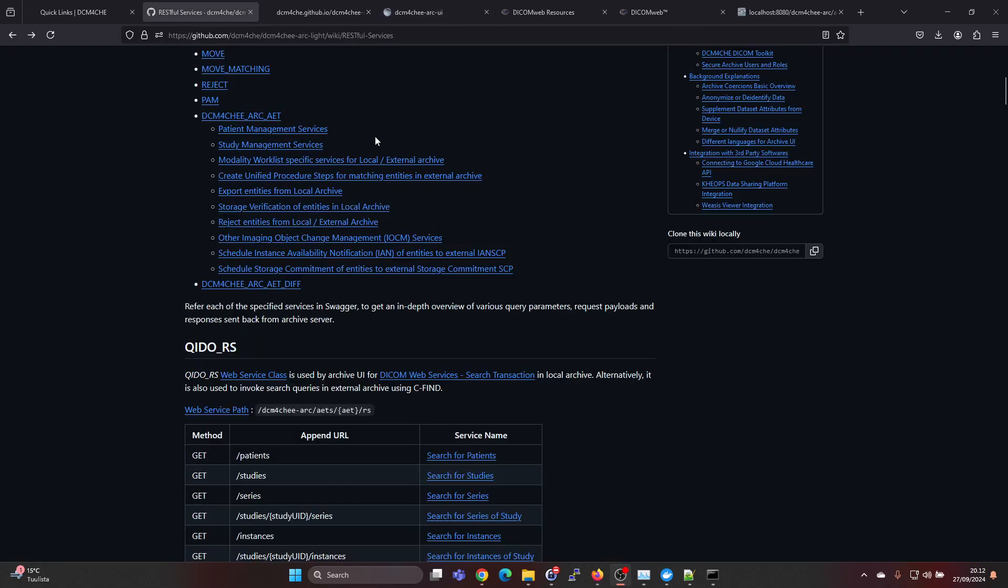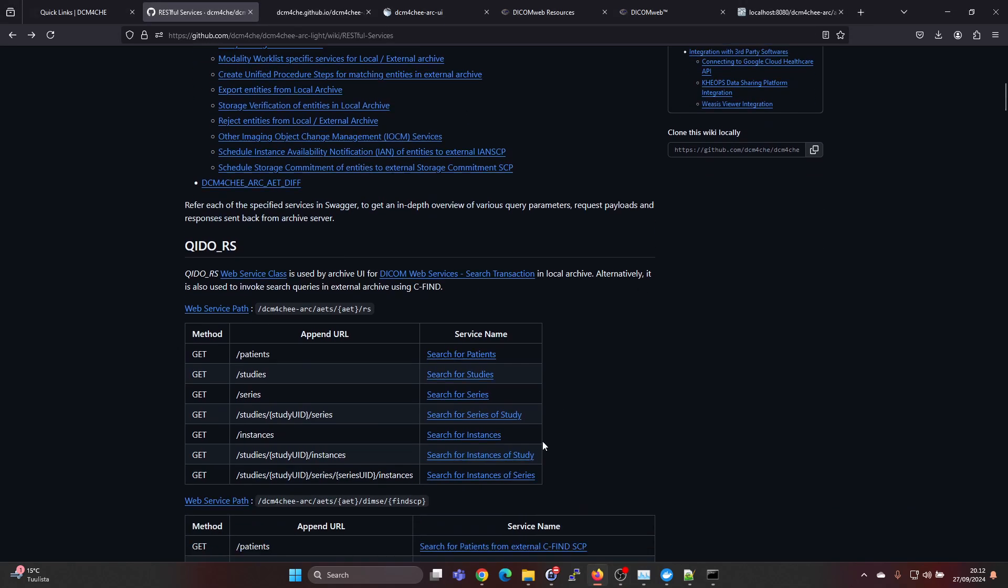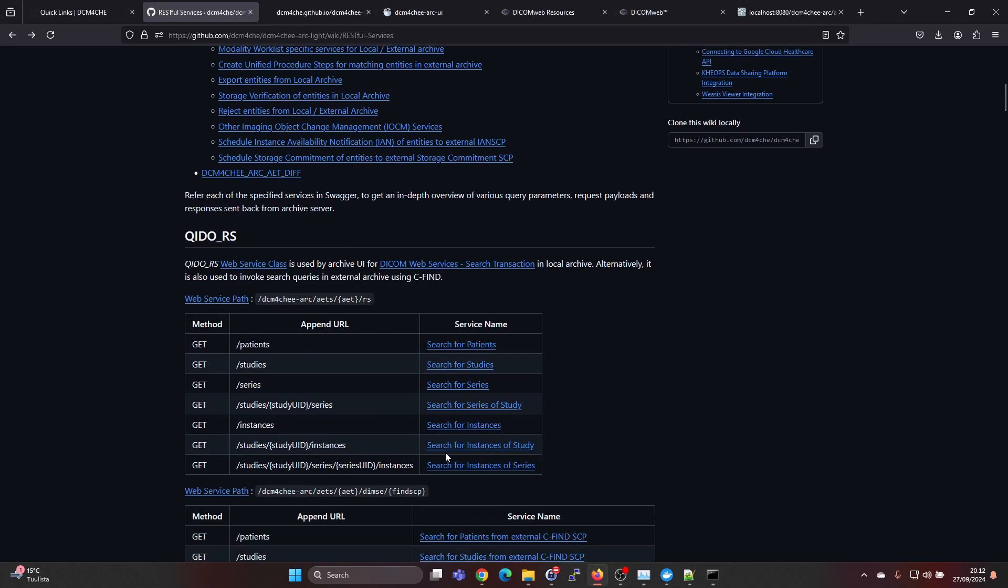Here in the documentation for Dicom4ChE archive lite, this is the archive 5, under restful services we can see all the services which have been implemented. For QidoRS there is get for patients, get for studies, series, and so on.